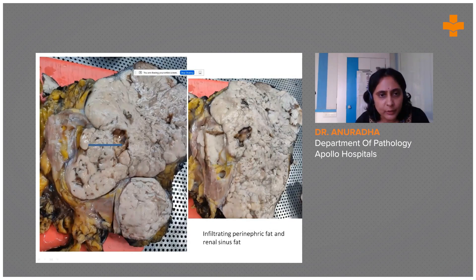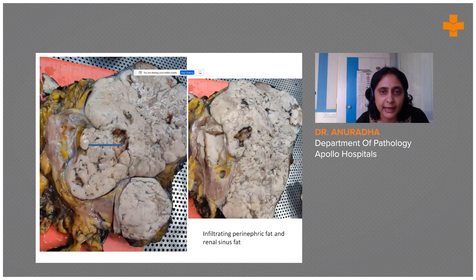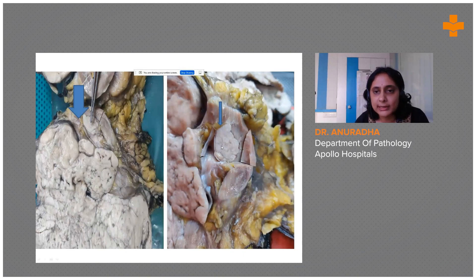This is the cut surface — a very fleshy gray-white tumor with some whorled areas. These are the areas of necrosis with little preserved renal parenchyma. This is the renal pelvis; the tumor is infiltrating the renal sinus and extending into the perinephric fat.